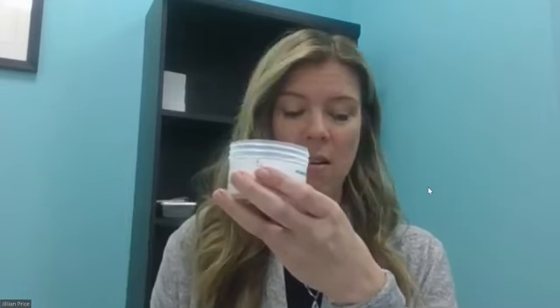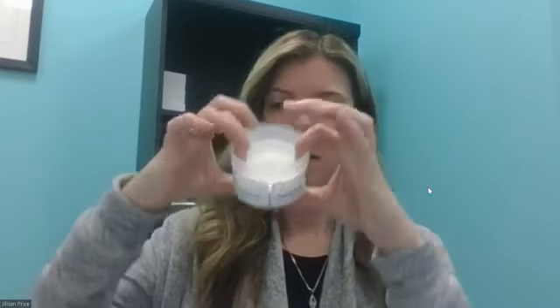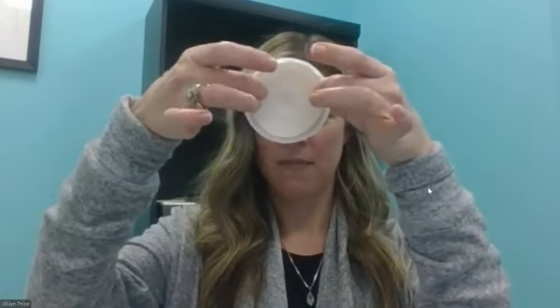So you want to be able to get the moisture that you can't see. That's when you need to use the drying cup. So what you're going to do is you're going to take your hearing aids out, wipe them off. You're going to open the battery doors. You're going to remove the batteries, and then you're going to put your hearing aid right on top of the phone. That's what it should look like.